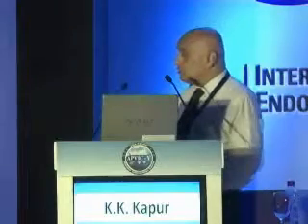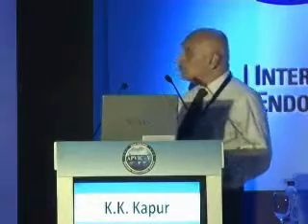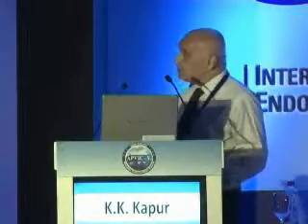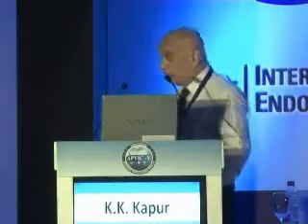This is the classical long axis of the saphenofemoral junction. And you can see the valves very clearly, the pre-terminal valve and the terminal valve. This is the valve which is seen, and you are applying the Valsalva strain, and during the Valsalva strain you will not see any flow. When you do the Valsalva release, then you get the blue flow because the flow is coming from the great saphenous vein and joining the saphenofemoral junction and into the common femoral vein. So this is a normal saphenofemoral junction.